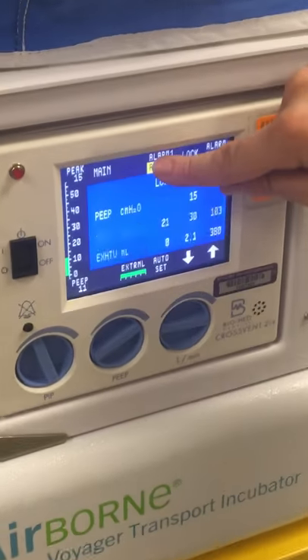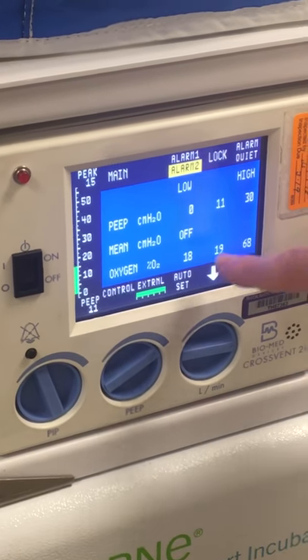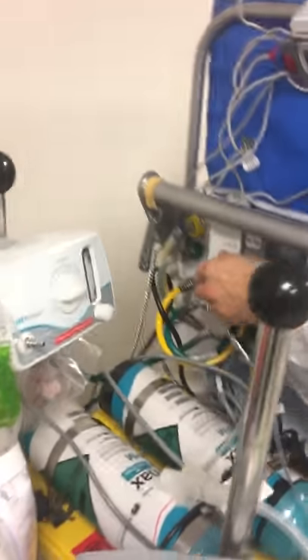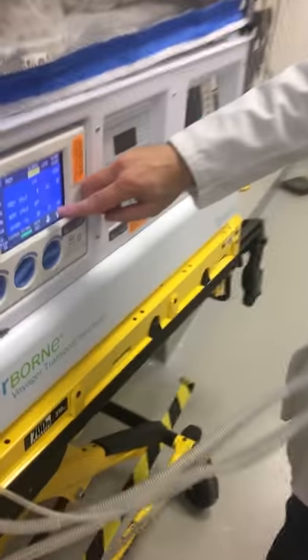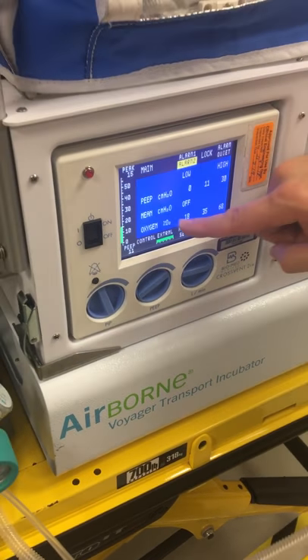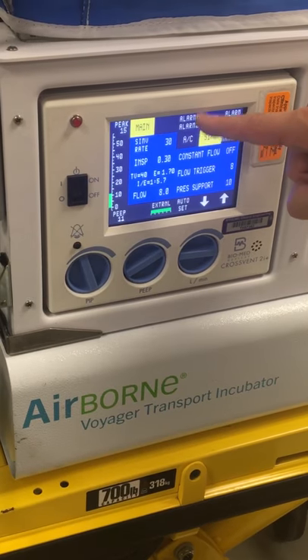Alarm 2: we have PEEP low, PEEP high, actual PEEP, and our O2 sensor. It's sensing the oxygen right now, and it's probably sensing low oxygen because our blender is set at 21% right now. As I increase my blender to 60%, we'll see the O2 sensor react accordingly. And then our mean pressure is not set. That's alarms.